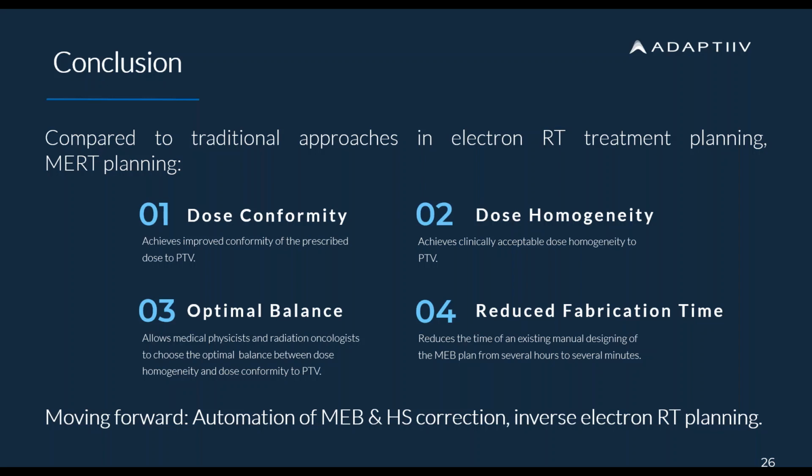previously, if you want to use any type of new material for 3D printing in radiation therapy, you would need to characterize and validate that filament in terms of its homogeneity, in terms of its density, physical and relative electron density, because you would need that in your TPS when performing calculation.